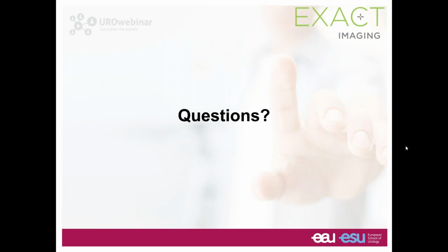Okay, so the next question is, what is the performance of multiparametric ultrasound for anterior tumors? This is a very good question, actually, because we know that prostate cancers are missed by MRI mainly when they are posterior against the rectal wall, and that multiparametric ultrasound, or just ultrasound, is missing anterior tumors.